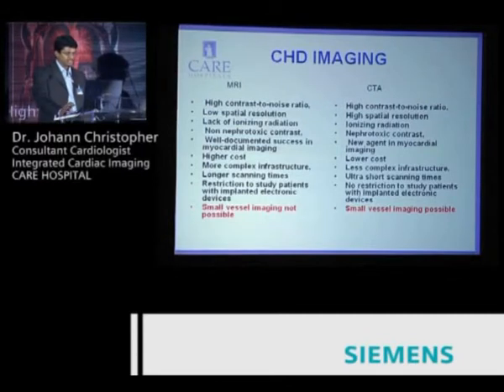So MR versus CT, it is always a sort of challenge for us because of a few issues. So I'm just going to go through some of the important highlights between both, and it also helps us to choose. So we know the obvious things which I already mentioned, but we have an MR scanner and we don't have a dedicated pediatric coil, so we just manage with the other coils which are available.